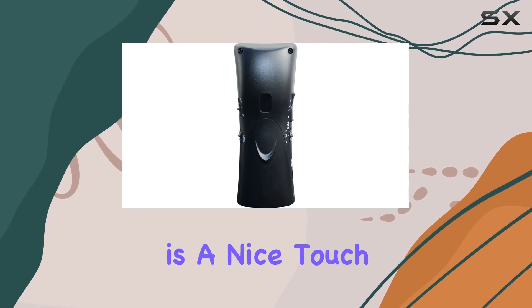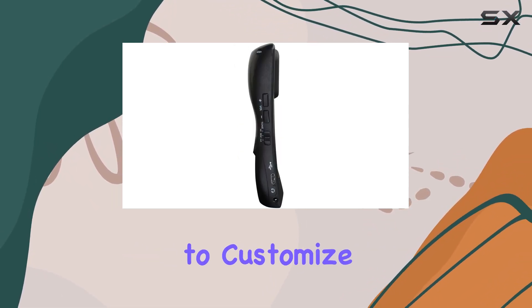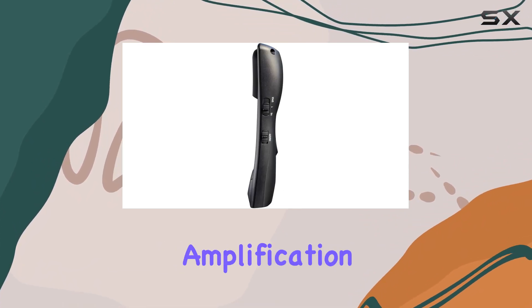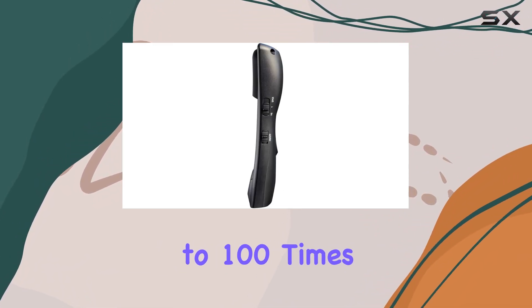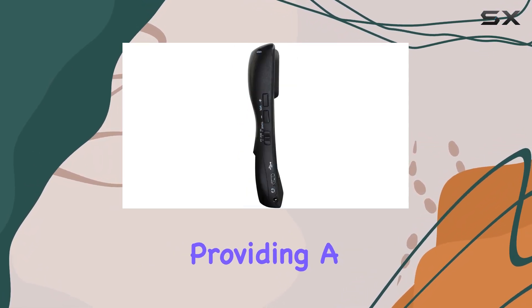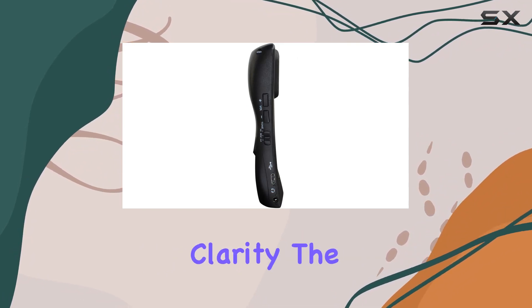The adjustable tone control is a nice touch, allowing you to customize the sound to your liking. One standout feature is the impressive 40 dB amplification, making it up to 100 times louder than your phone — a game changer for those with hearing difficulties, providing a significant boost in audio clarity.